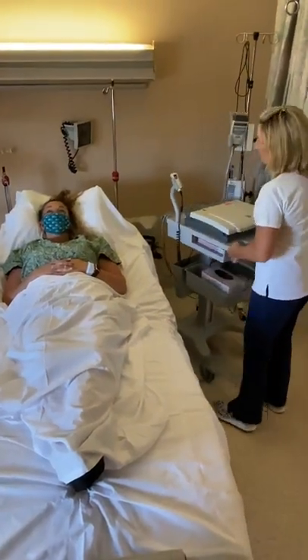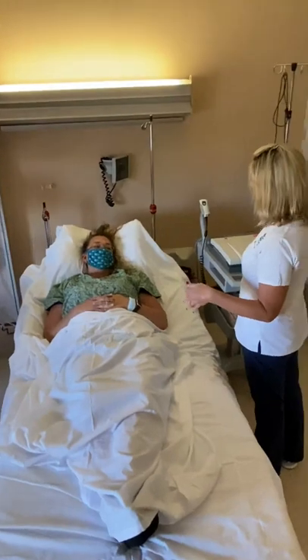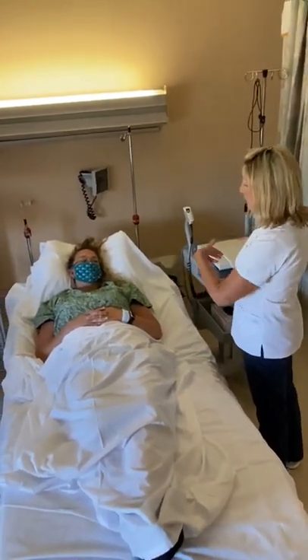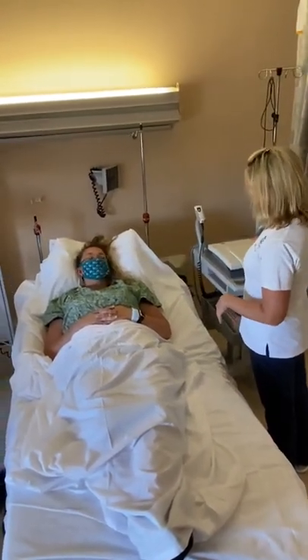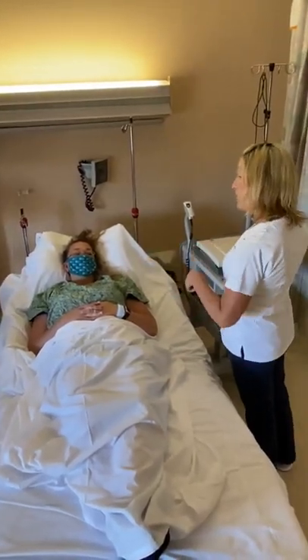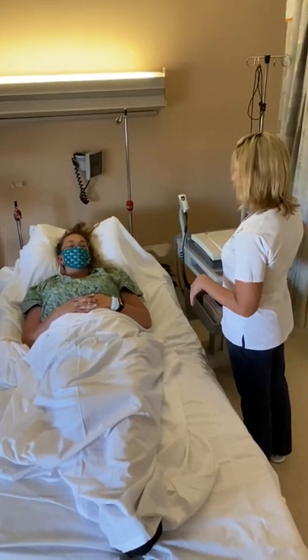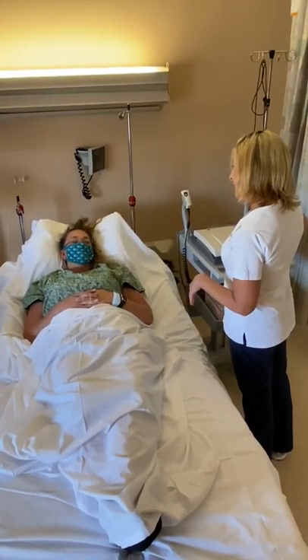Have you ever had an EKG before? No, I haven't. Okay, so it's easy, non-invasive. You're not going to feel anything. I'm just going to put a bunch of stickers on your body, one on each leg, one on each arm, and a few on your chest. And it's going to give me a picture of what your heart's doing. Okay. Is it okay with you if I do an EKG?